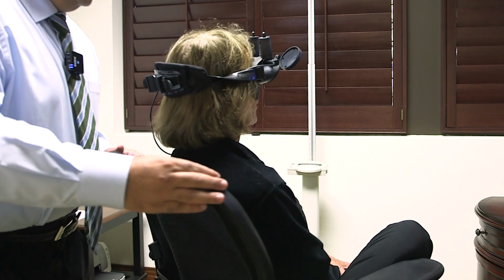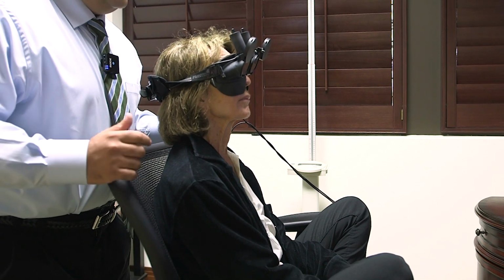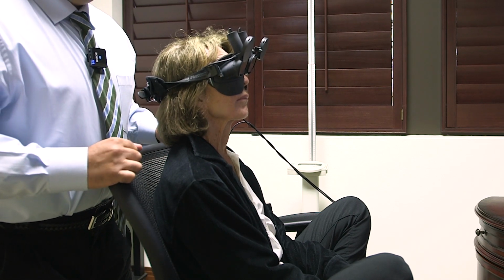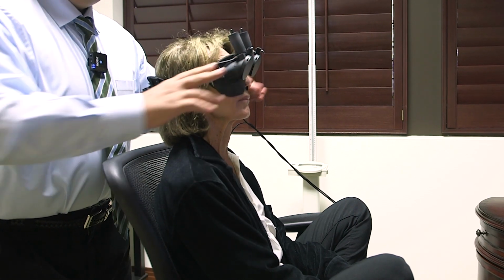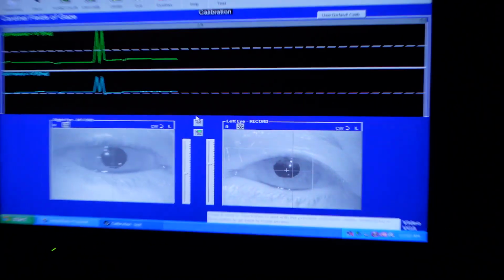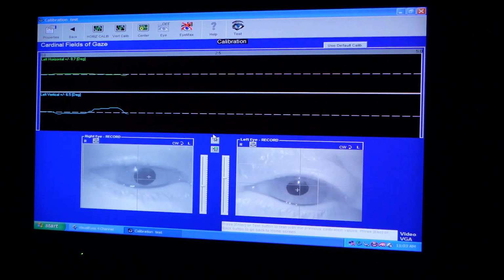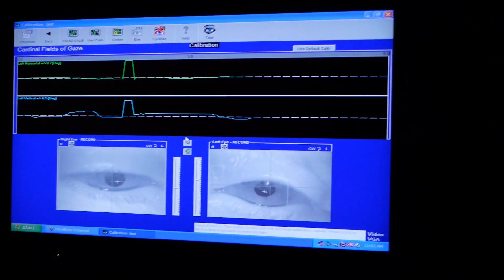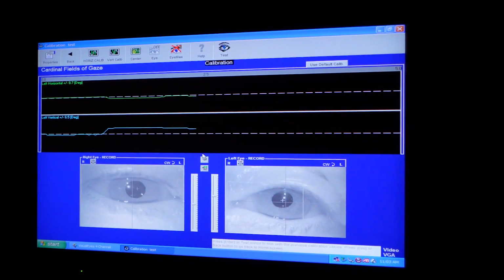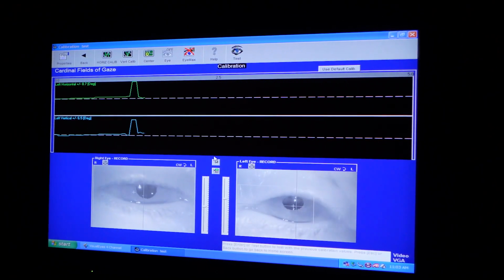I'm over here. I need to check to see if you have something called nystagmus. What I have to do is close these so you don't see anything, okay? Okay. I'm turning these on and off too. Okay, so what we're doing now is we're just checking to see and differentiate between central and peripheral vestibulopathy. So in darkness, usually what we see is nystagmus. Kathy, you don't have any nystagmus. We're just taking a look at your eyes here. But we'll see beating of the eyes.